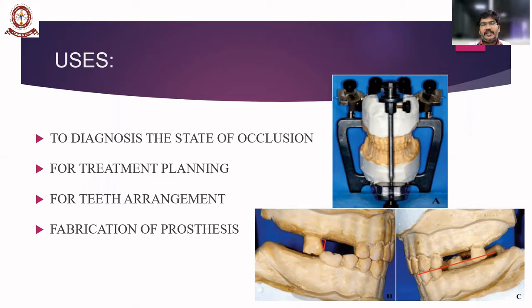It also aids the operator to explain the treatment procedure to the patient in an understandable manner. And it also gives you a clinical outcome or the result of the final prosthesis. This is very helpful in teaching the patient or to motivate the patient for the treatment.